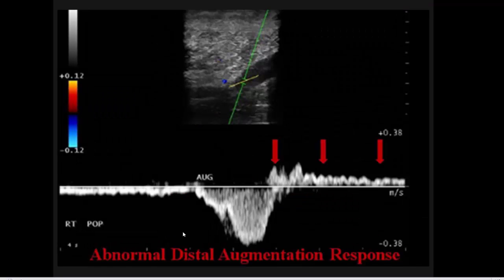Abnormal distal augmentation response: we find augmented flow — sudden rise of flow — then reverse flow. This is a sign of reflux, with a reflux area present between the site of compression and site of examination. Abnormal augmentation may be present in blocked DVT or reflux.